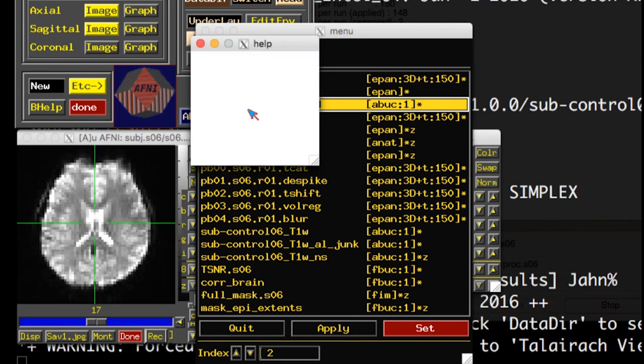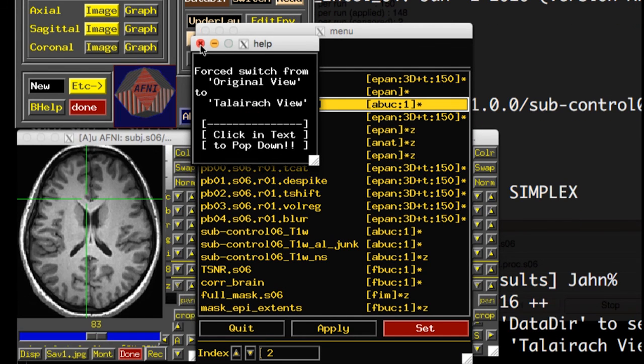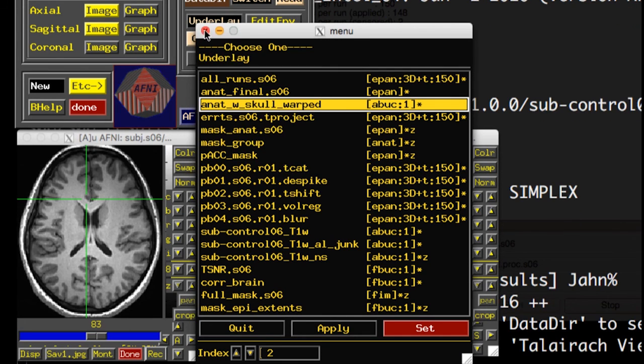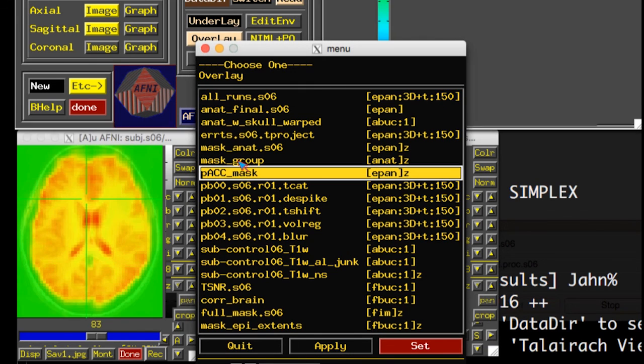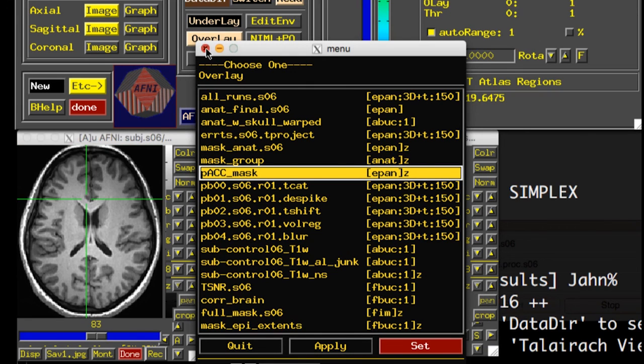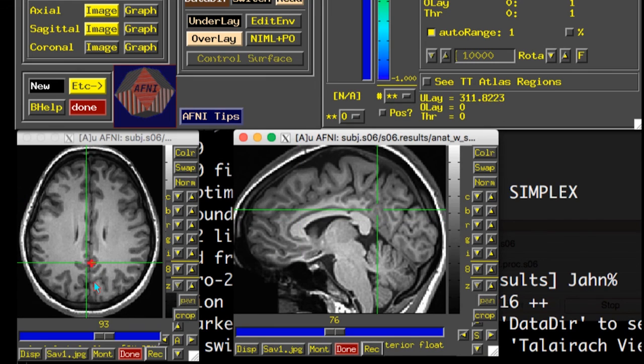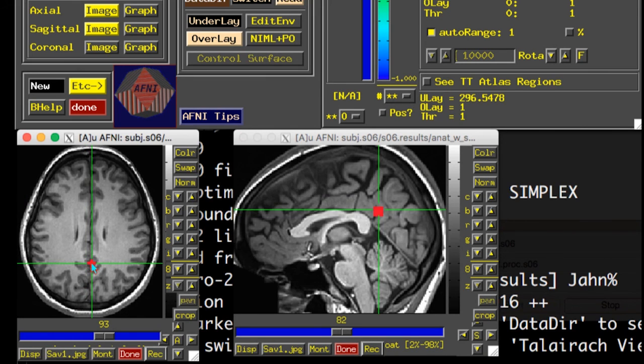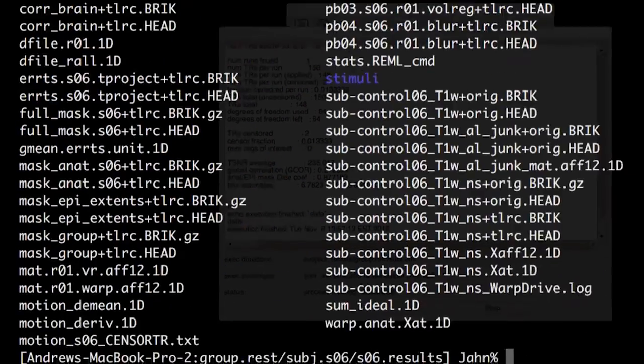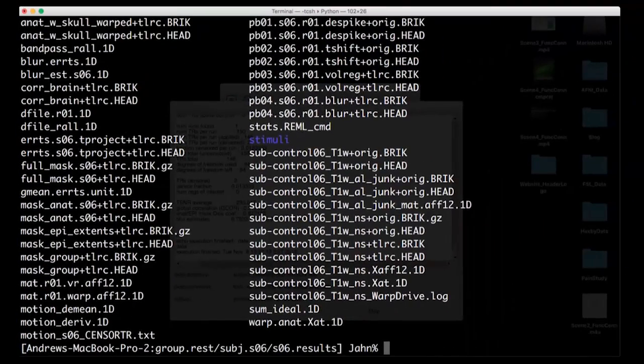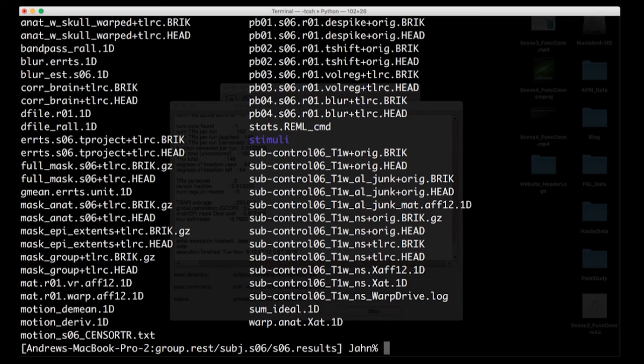So I'm going to go back to my warped anatomical image, and I'm going to overlay this PCC_mask right there. So everything in red is what's going to be my mask. That's what I'm going to average over to extract my time series. So just double checking and just trying to give you the sense that you should really double check each step that you do. Easier said than done. I don't always do it, but you should.